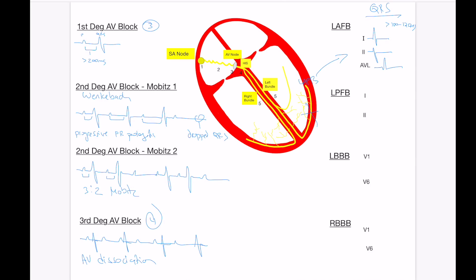In the left posterior fascicular block, what you're going to see is the opposite, where lead one the vector is negative, and lead two you'll get a positive vector. This is indicative of isolated left posterior fascicular block. This is much less common than the left anterior fascicular block, but you may see it from time to time.